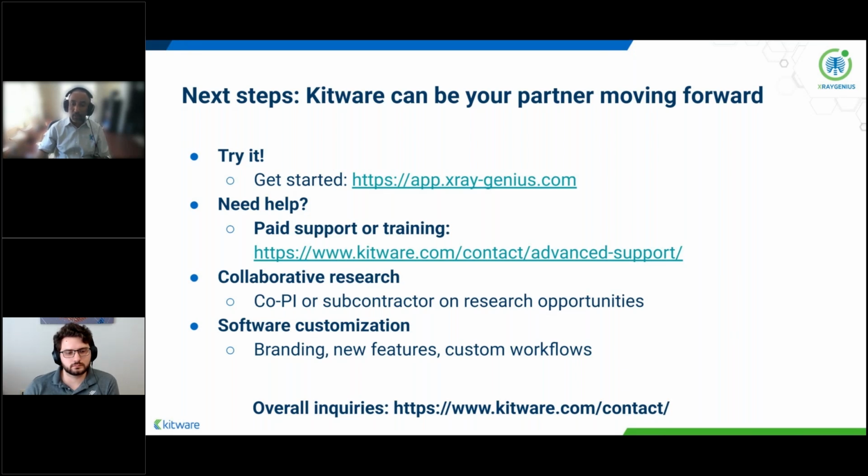So you could use those sample data and play around with the different features of X-Ray Genius, and that will give a good sense of the workflow within the application. And this particular managed service is running on AWS as we described earlier.